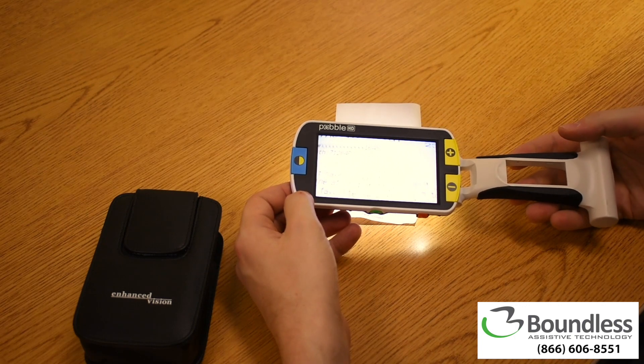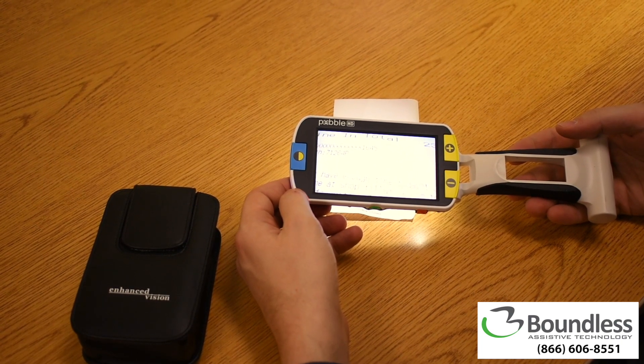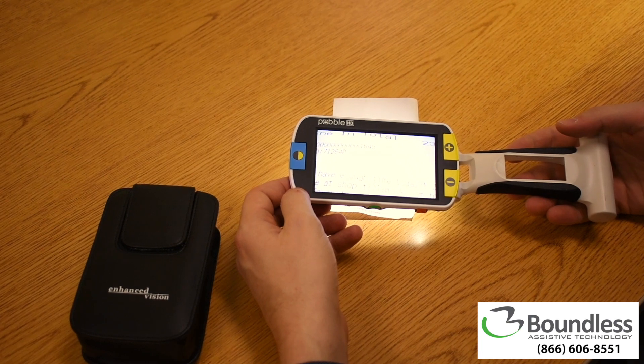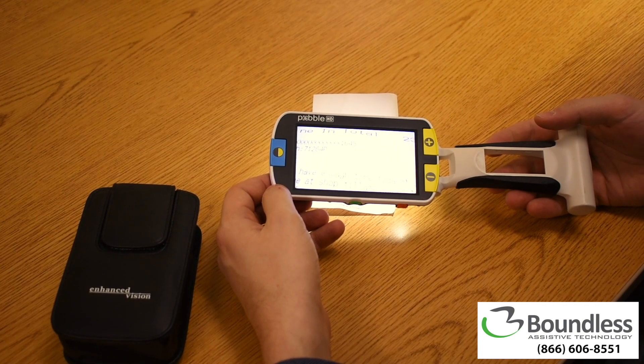As a handheld video magnifier, the Pebble is a great tool for visually impaired folks looking to have visual independence on the go. Small enough to take with you, it's perfect for quick reading tasks like checking price tags at the grocery store, reading pill bottles before bed, or reading off the meal choices at a new restaurant.